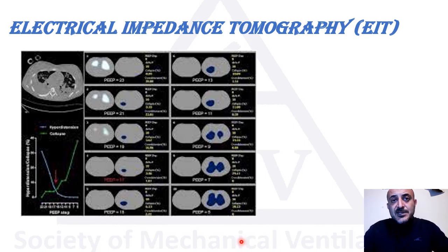I think this is going to be very important and will revolutionize mechanical ventilation setting PEEP. And hopefully in the next decade or so, we'll know more about this technology and we're going to be using it more.